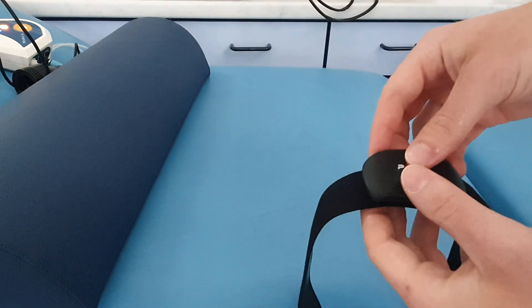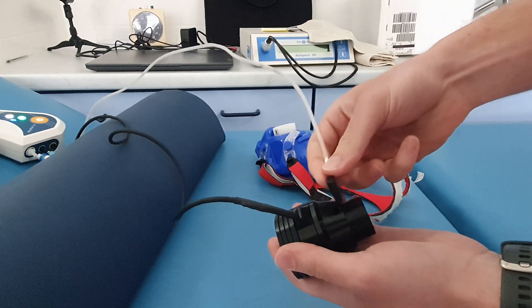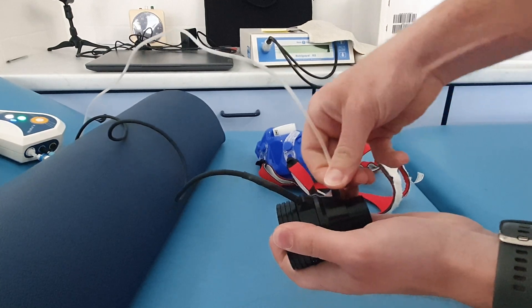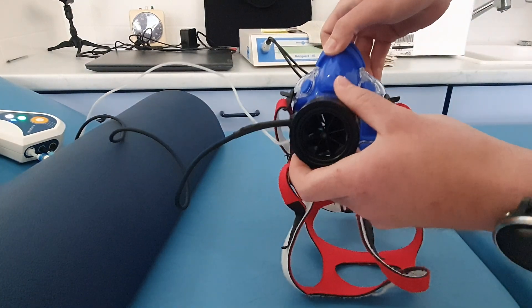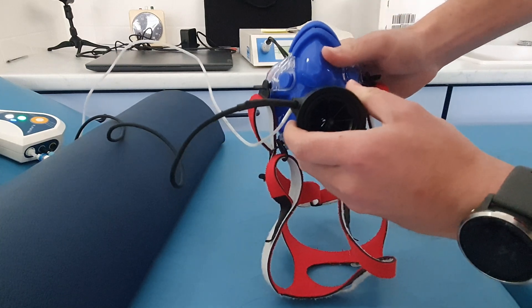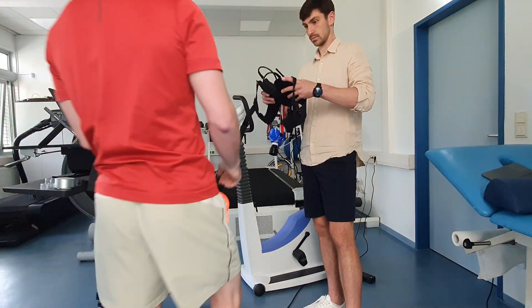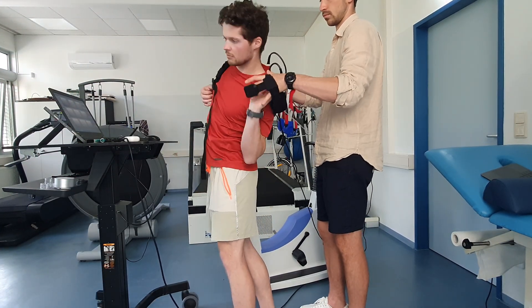The pulse sensor is activated by clipping it onto the chest strap. The small black plug is replaced by the gas sensor hose. The turbine adapter is plugged into the mask. It is important that the outlets point upwards to prevent liquid from being sucked in. The unit is fastened in the shoulder strap.